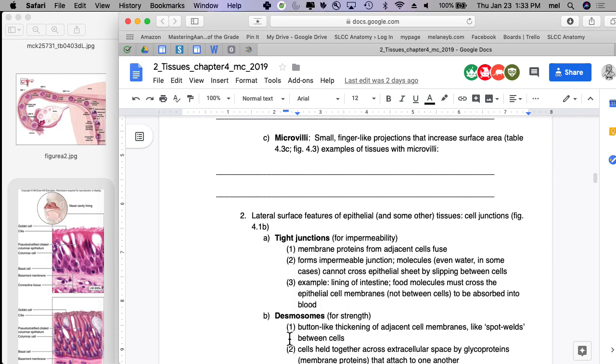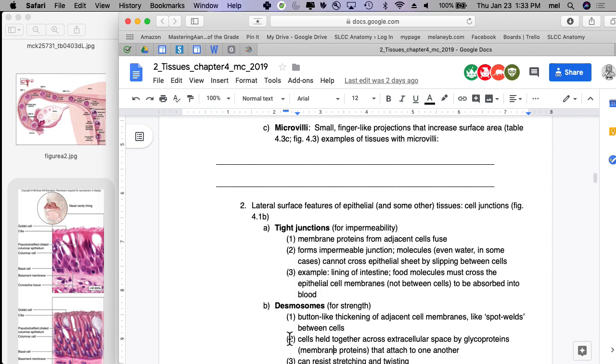And then if you run into distinct microvilli, the only tissue that you found with distinct microvilli is what? Simple columnar, right? So you're using these criteria to help you check, to make sure that you have the tissue that you thought you had. Do you understand what I'm trying to say to you guys? So it's not just rote memorization. It's not looking at a picture. It's like, oh, I know that in this tissue I should see this, or I don't see this, right? To figure that out. Okay.